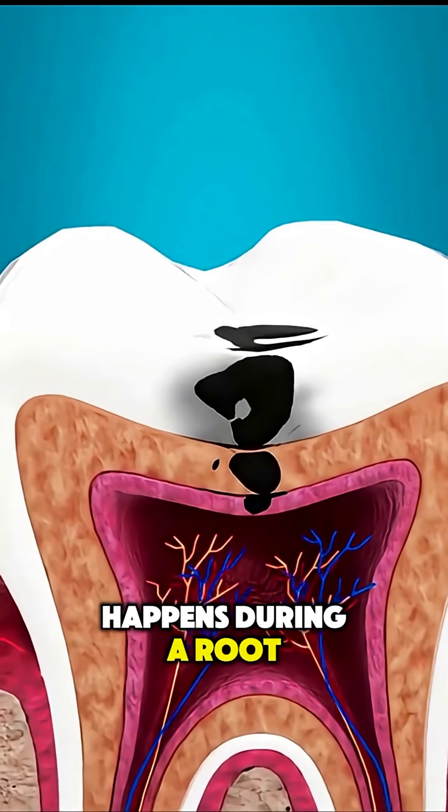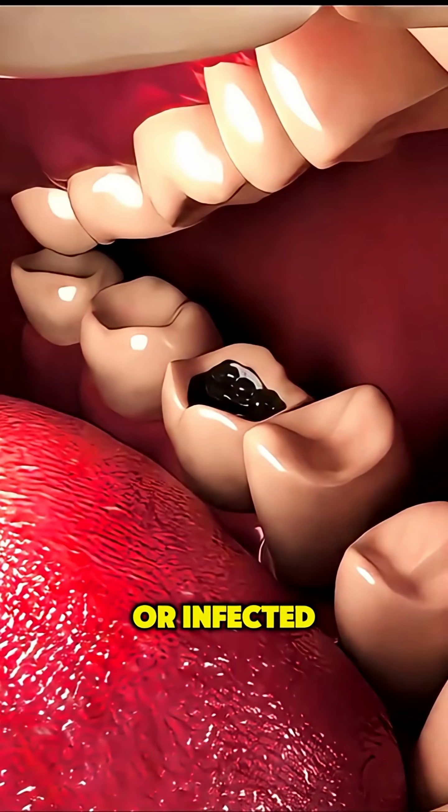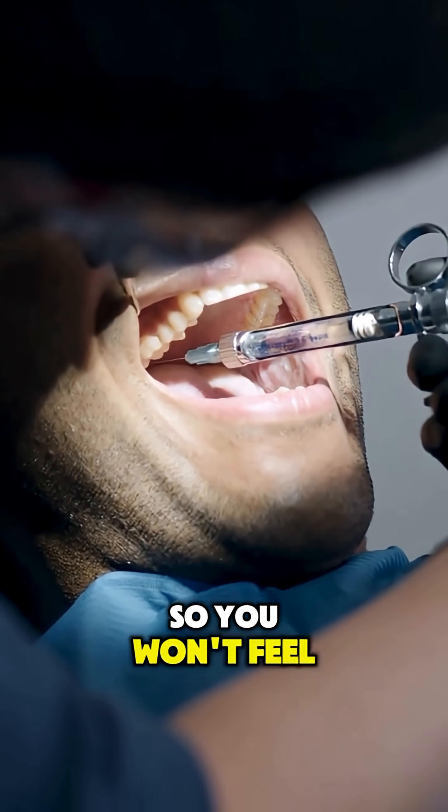Ever wondered what really happens during a root canal? It's a procedure designed to save a badly decayed or infected tooth without removing it. First, the area around the tooth is numbed so you won't feel pain.